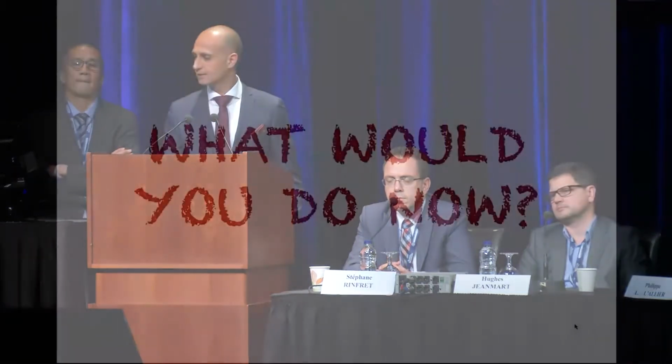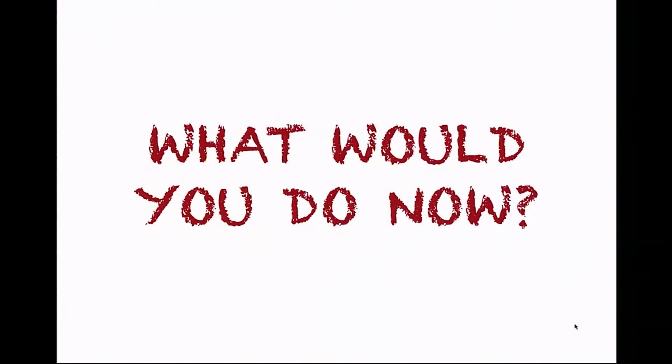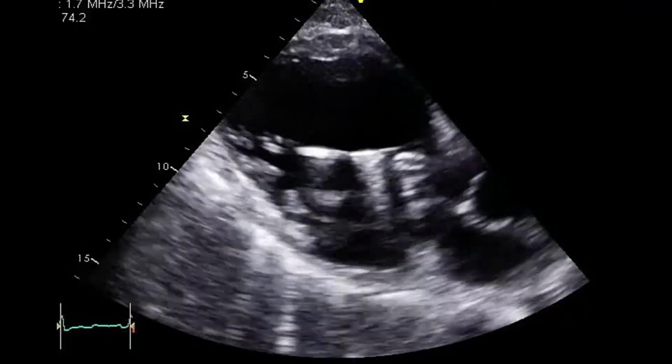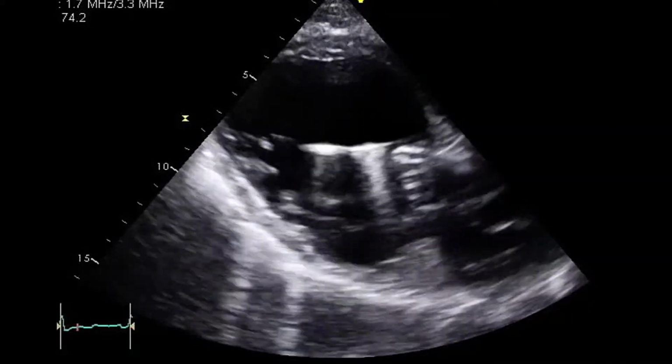Can I have my slides? So at this point, this is how the LV becomes. So we had a little bit of LV before, now there's almost no LV left.